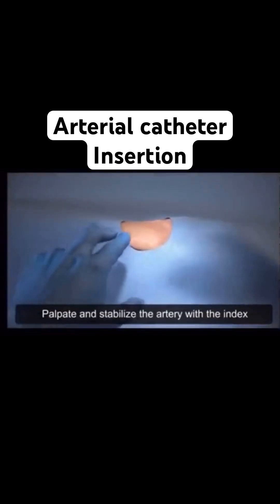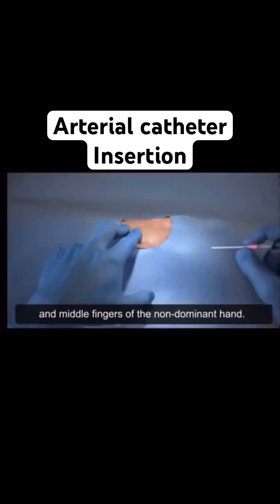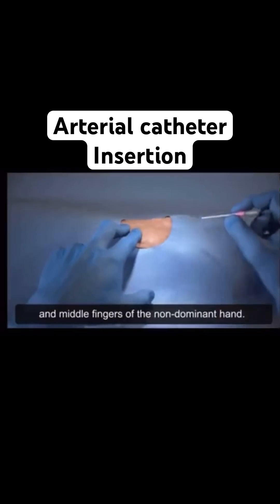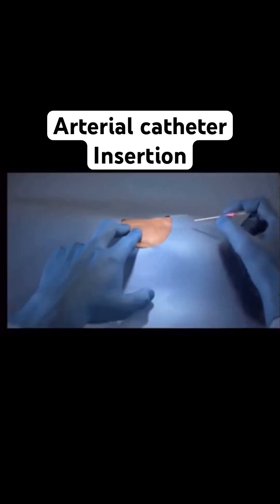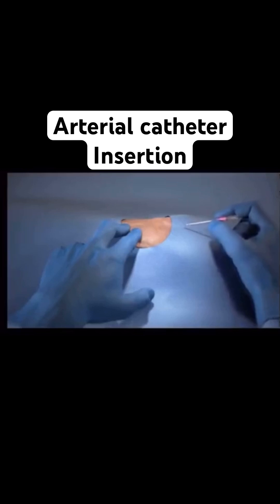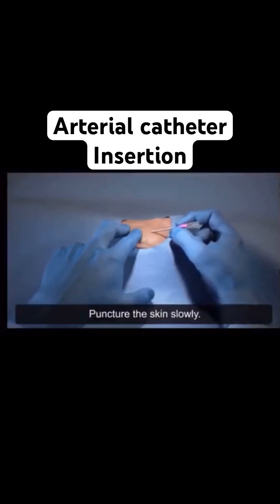Palpate and stabilize the artery with the index and middle fingers of the non-dominant hand. Puncture the skin slowly.